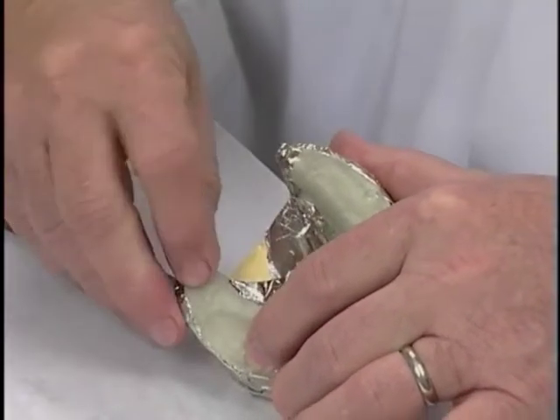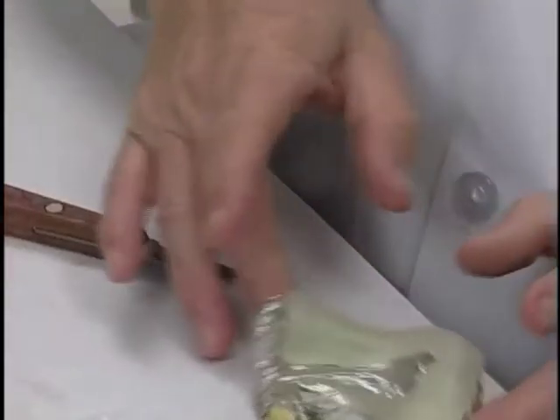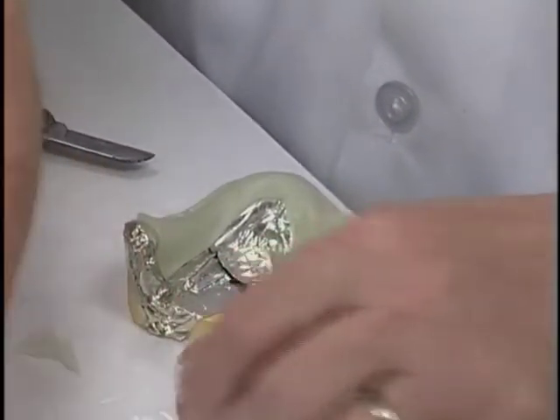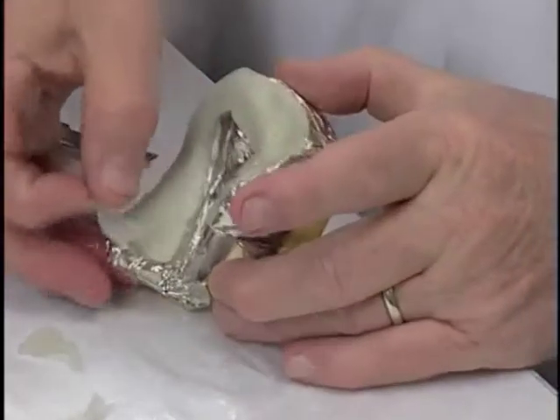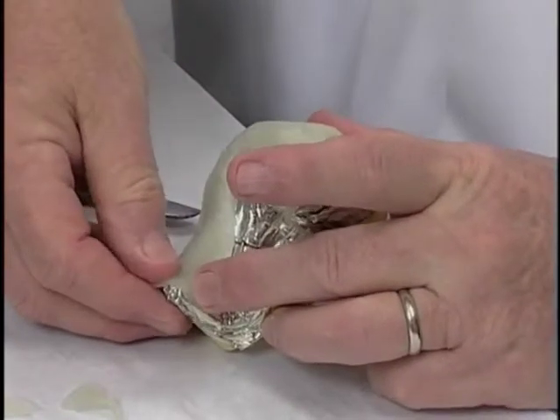And all we need to do is just to push it and mold the material together with it in that area. And a little bit on this posterior, just to make sure we have everything covered.